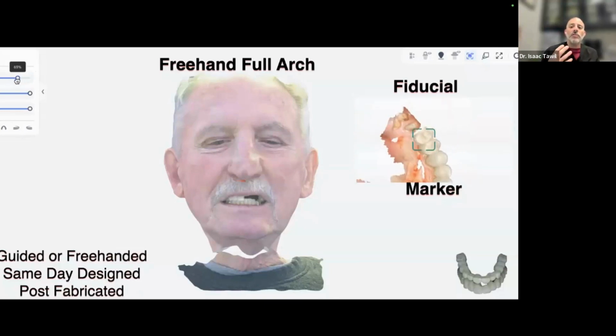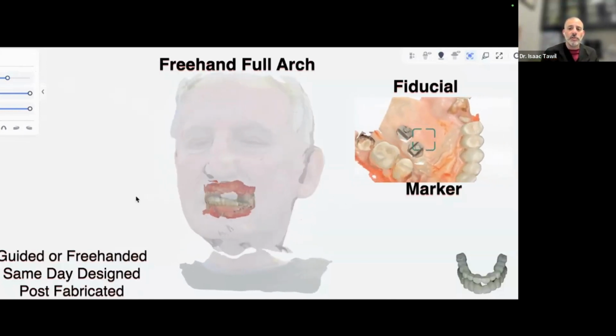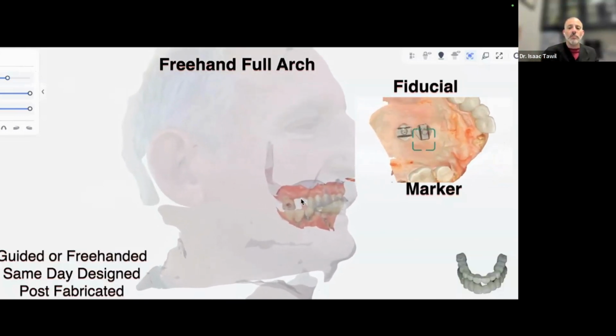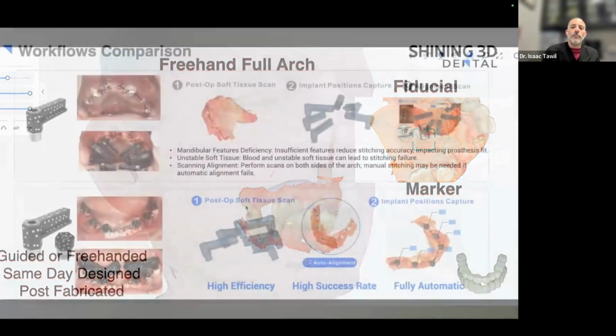We will scan to the fiducial marker. We'll scan the teeth to that fiducial marker. In this case, we have two fiducial markers that you see in the upper right corner there. We took a facial scan for the patient. We're going to remove all his upper teeth. And then we can do, again, one or two things.